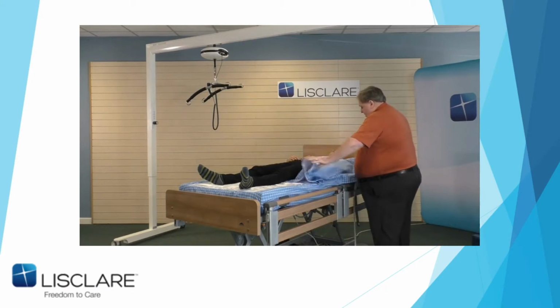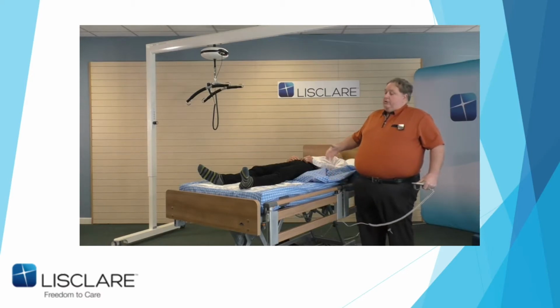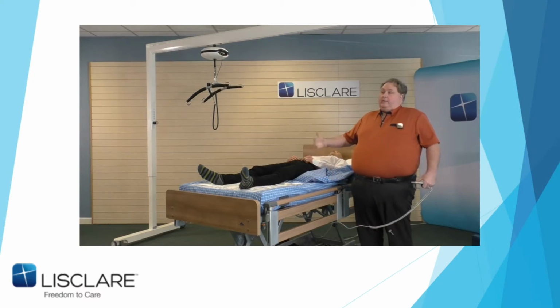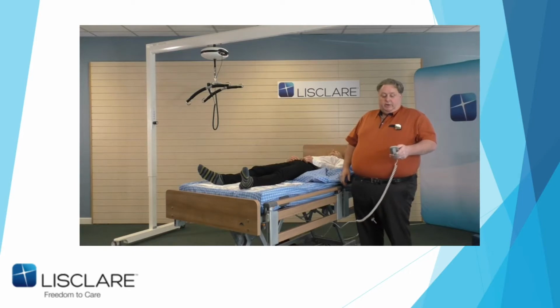Now, why patients come down the bed in the first place is to do with the profiling of the bed. Unfortunately, the human body doesn't profile the same way as a nursing bed. And again, there's a lot of reactions from clients or people in bed that they don't do certain things in a way. They seem to stiffen up. So if I sit John up, okay, I'm just going to elevate the leg rest section first.